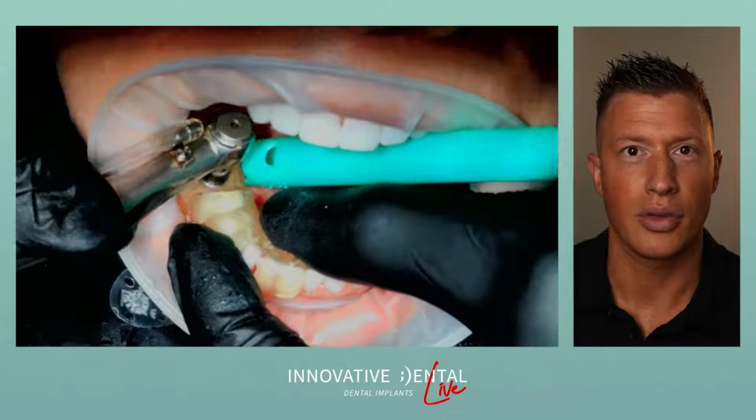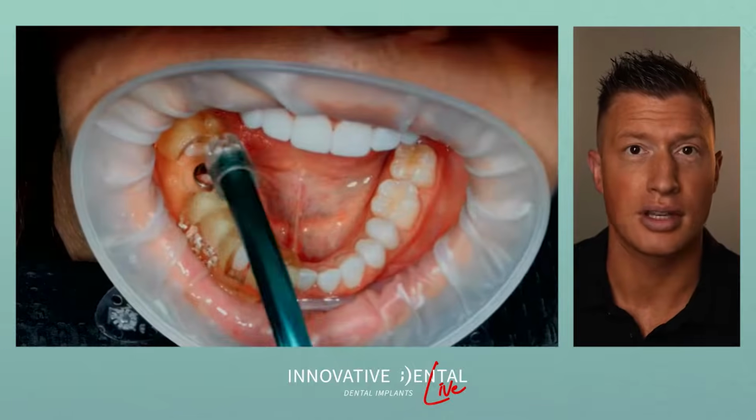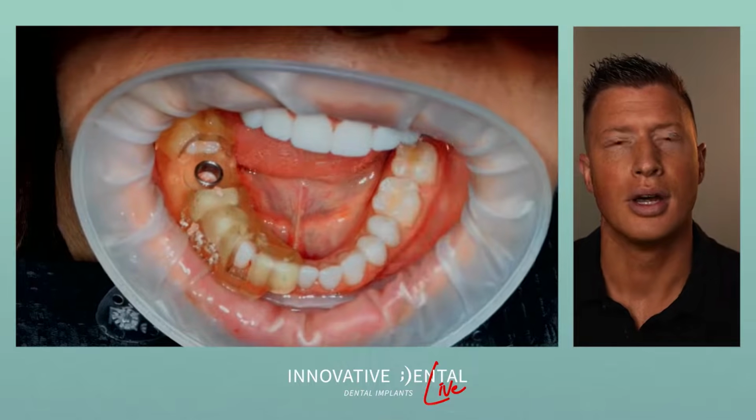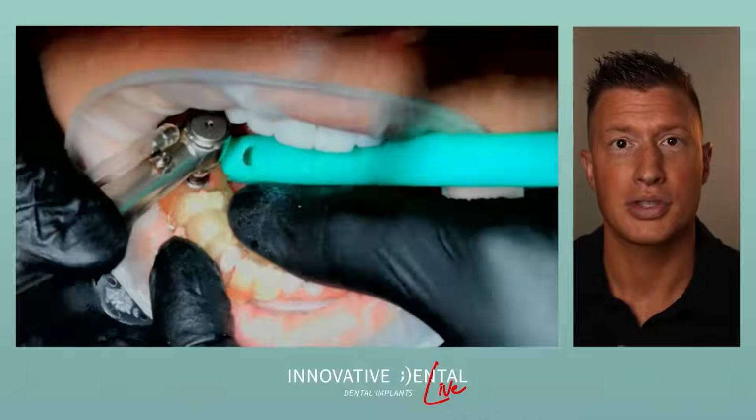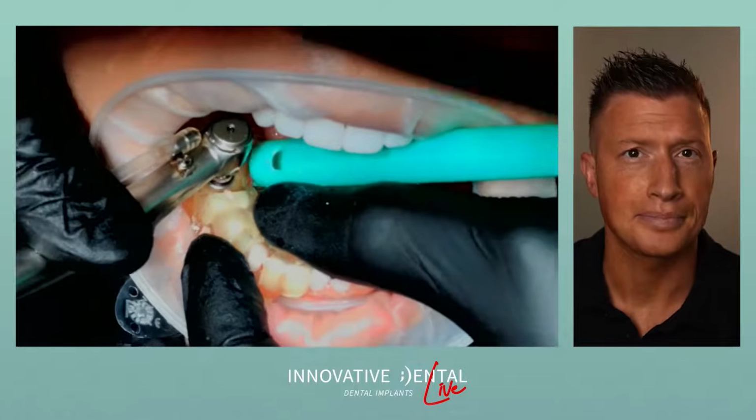And so we'll do this again. Now we're going back in with a little larger. This is actually a 3.0. I can tell by the shade of that ring. It's a 3.0. So 3 millimeter diameter. That was a 6. Here's an 8 and a 10.